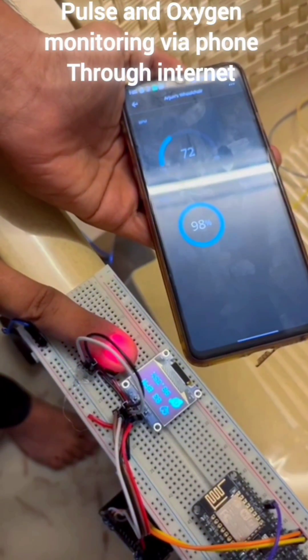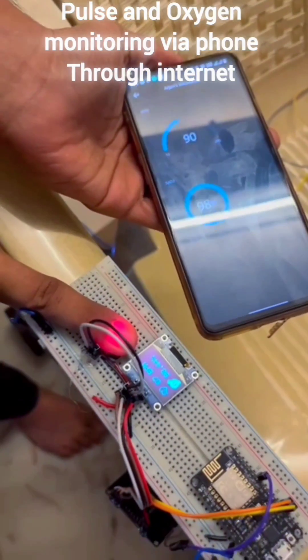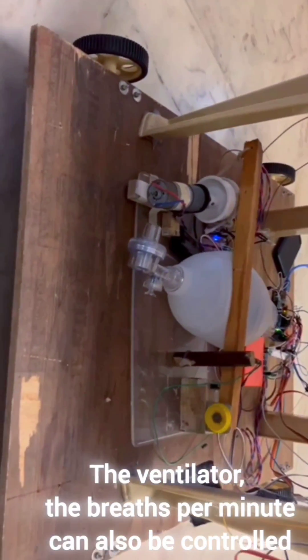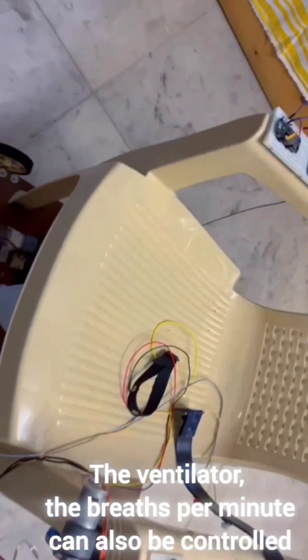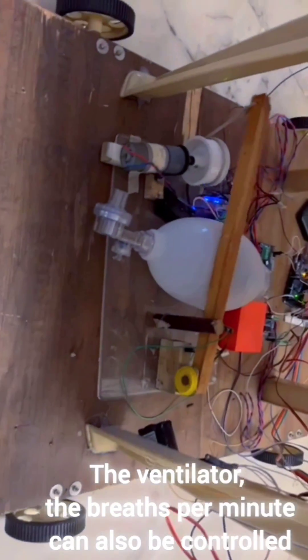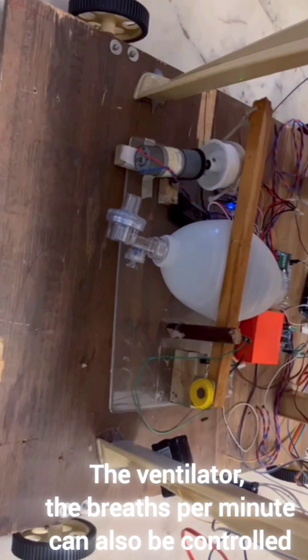Now this is the pulse and oxygen monitoring via phone through the internet. Here comes the ventilator — the breaths per minute and speed can also be controlled. These are made from Ambu bags, which doctors control manually by hand, so this can be replaced by motors and used as a ventilator in critical situations.